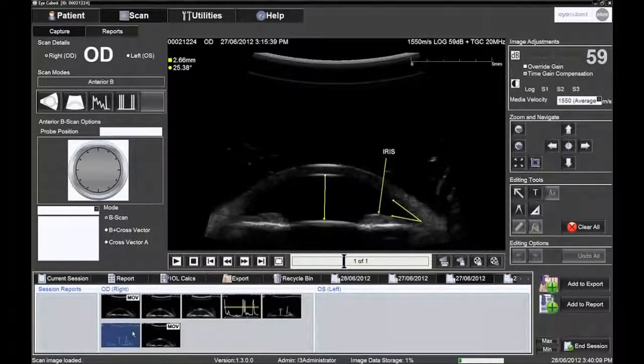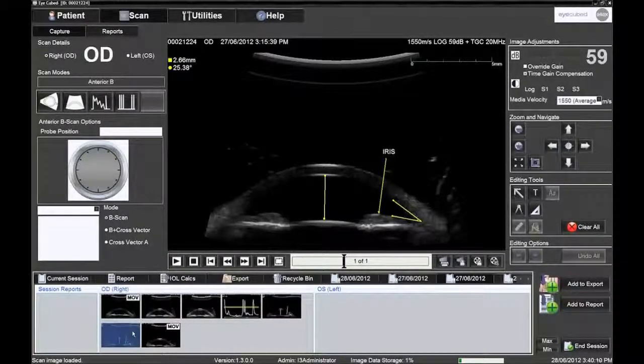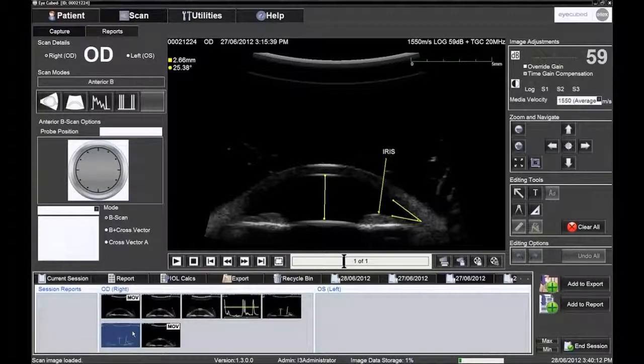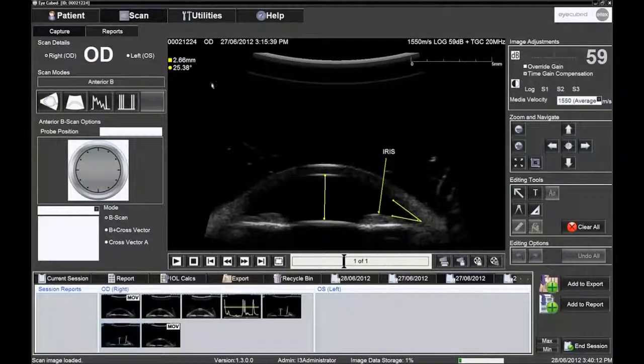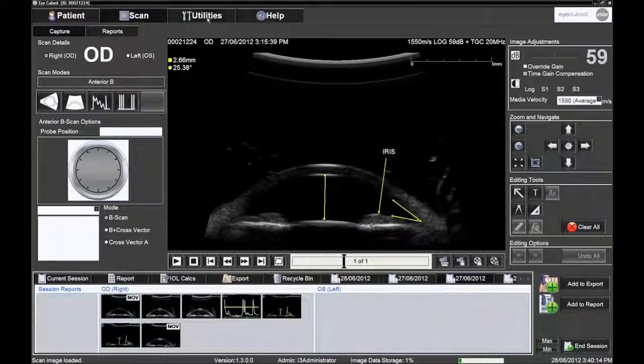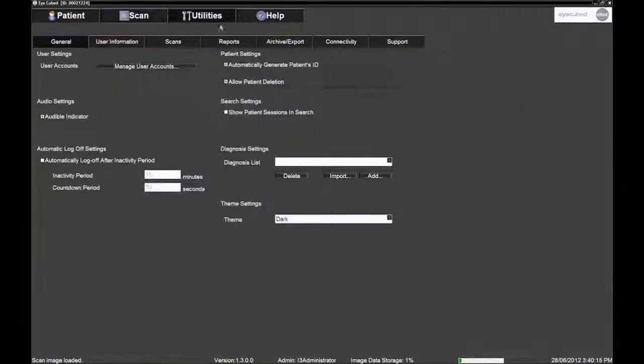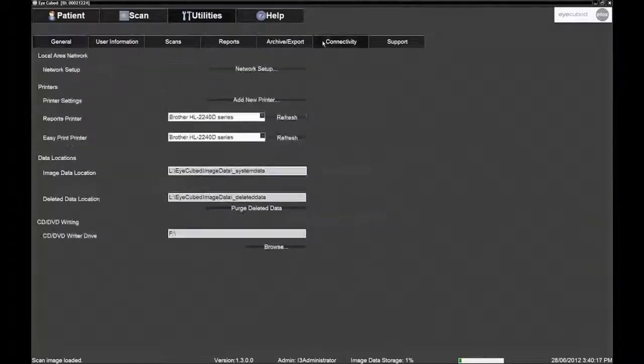The print job is sent to the default printer that has been pre-selected in the EasyPrint printer drop down box located within utilities under the Connectivity tab.